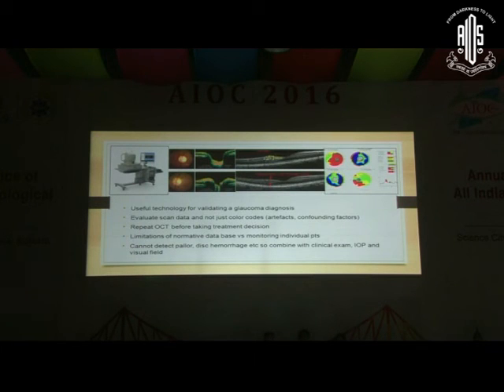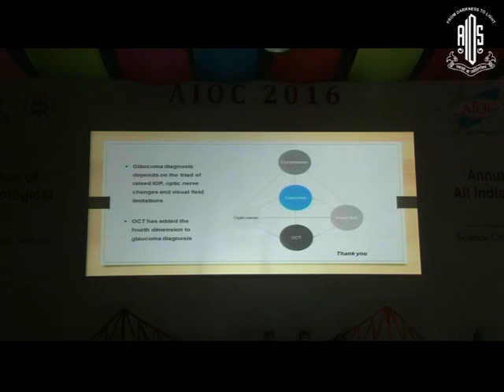Finally, OCT is a useful technology to validate a glaucoma diagnosis. Like I said, evaluate the scan data, not just the color codes. Repeat an OCT before you take a treatment decision. Remember, your individual patient that you're following up will give you far more information than just the OCT normative database. And you're not able to detect pallor, disc hemorrhage, etc. So please combine the clinical exam, the IOP, and the visual field.